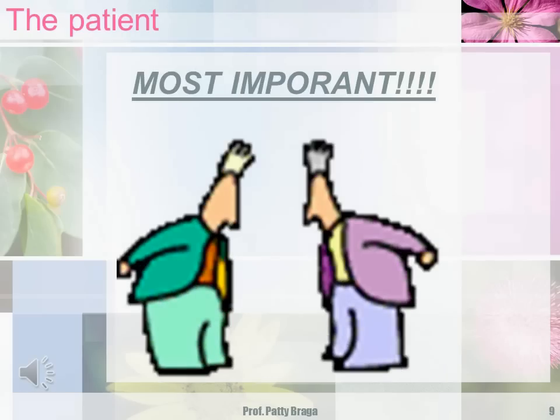Did you say greet the patient for the answer to this question? I think a lot of us will put ID the patient as the first step. But really, the most important thing to do is to introduce yourself to the patient, say hello, and then ID the patient. Explain the exam, ask about the prep. Did they drink if they had to, or are they NPO? Had they been fasting overnight?